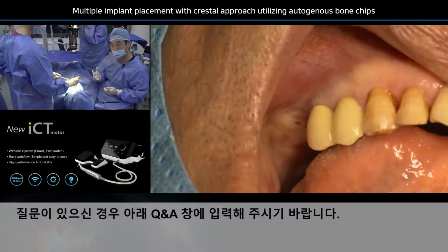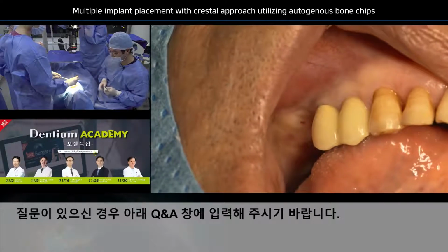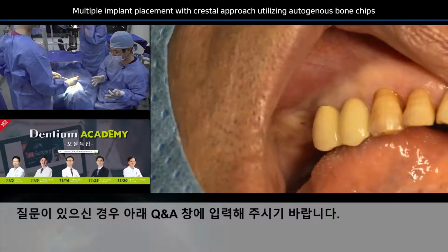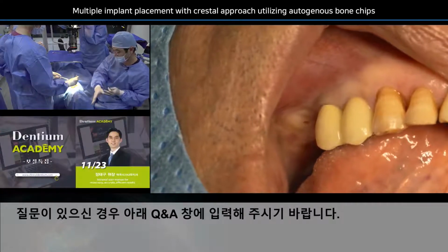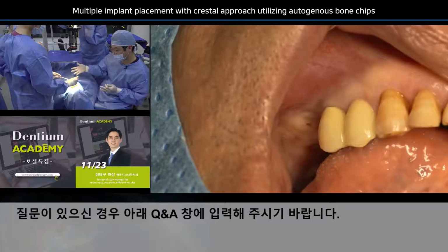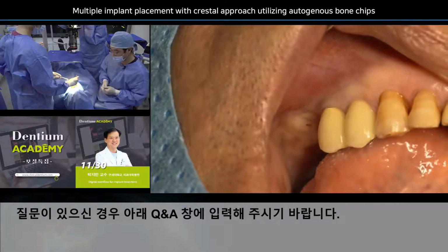If you are right-handed, you can approach like this. Please leave your comment here. What is your best approach for the 16 and 17? Do you prefer the top of the head, or you may go to the 3 o'clock, or you may go to the 9 o'clock, but it's up to you. So I want to hear your opinions.